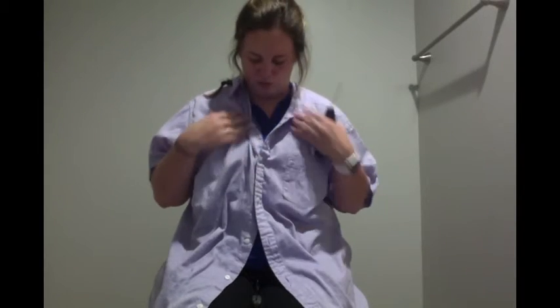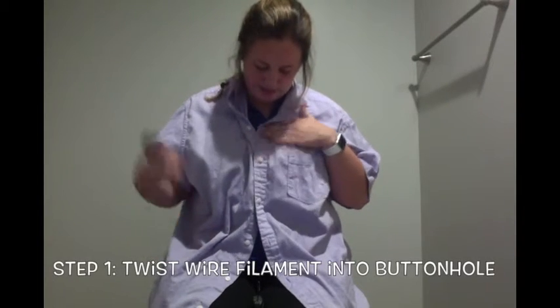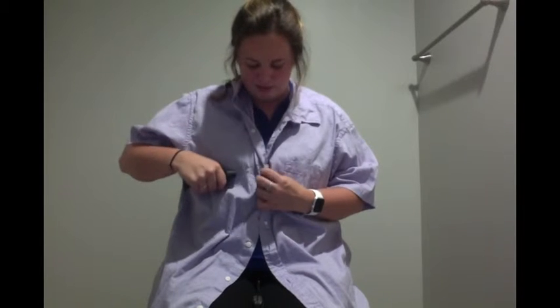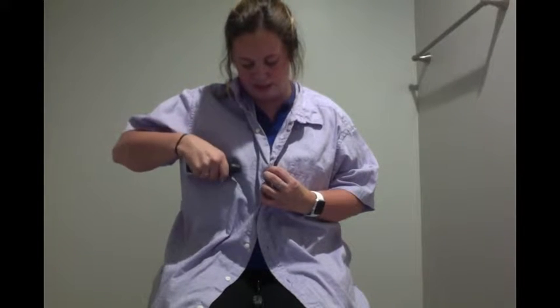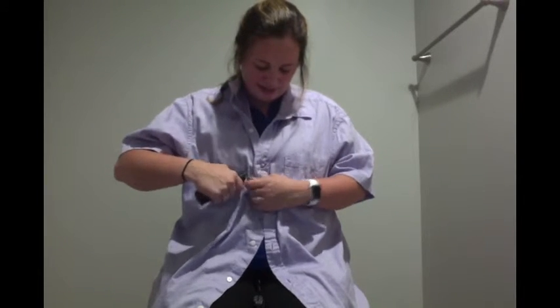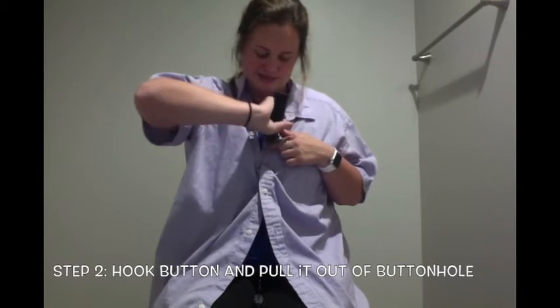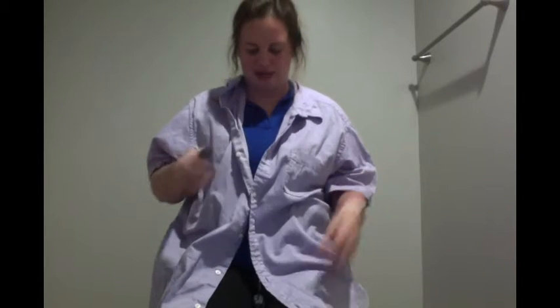Next we're going to work on unbuttoning our shirts, which you can also do with the button hook. You're going to stick the wire filament back through the buttonhole, which is going to be a little tricky since the button is in there. Don't worry — you're going to get the button and twist until you get it unbuttoned.